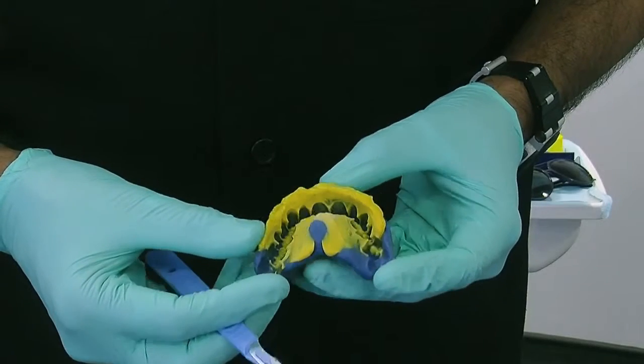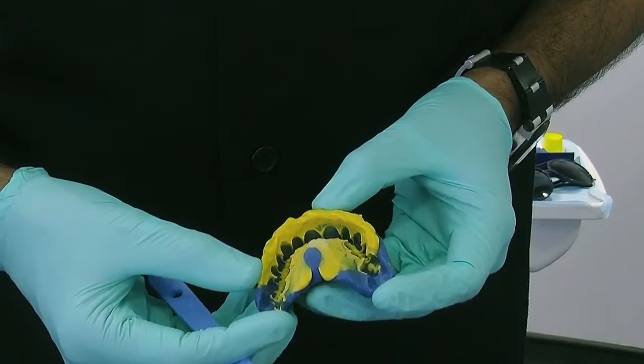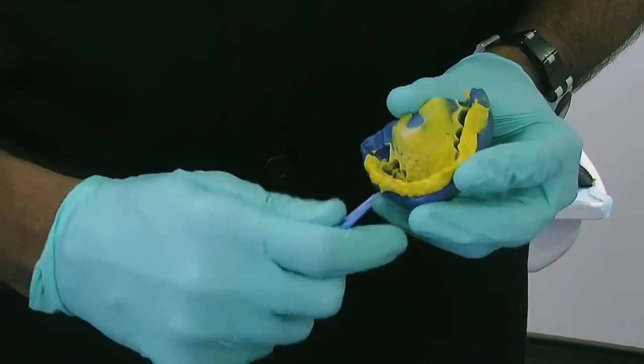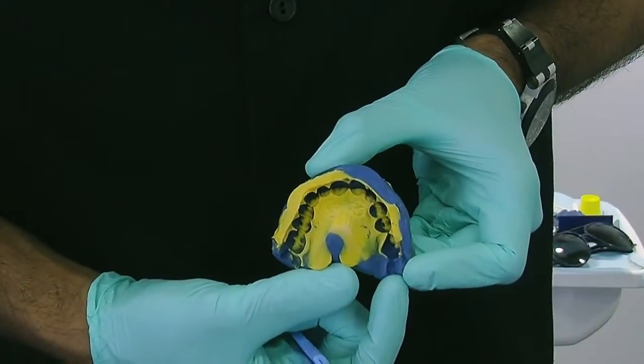We now have the putty wash index of the wax-ups that I took earlier on. What I'd like to do now is just trim up these excess parts and improve the shape of this. I'm just using a normal scalpel. Okay, it's all ready to use now.